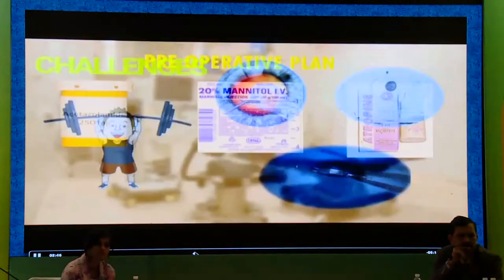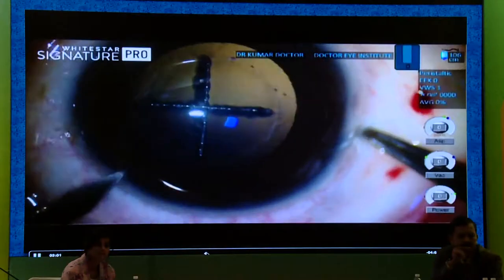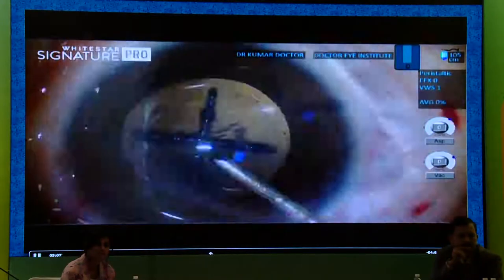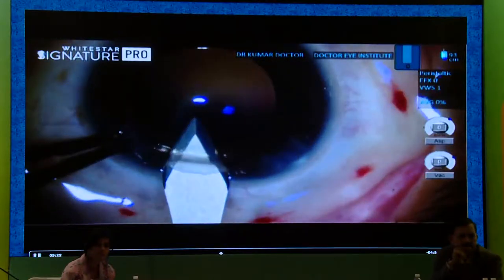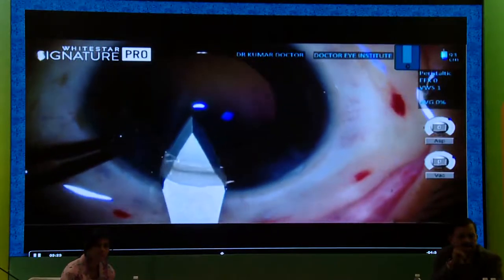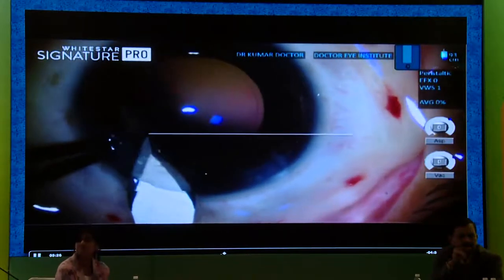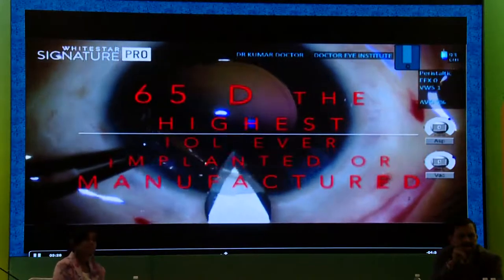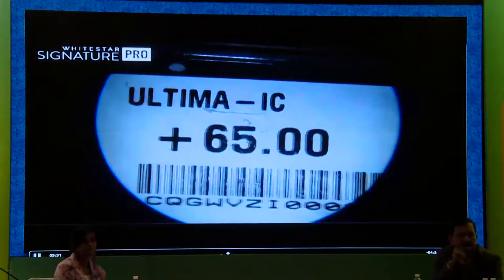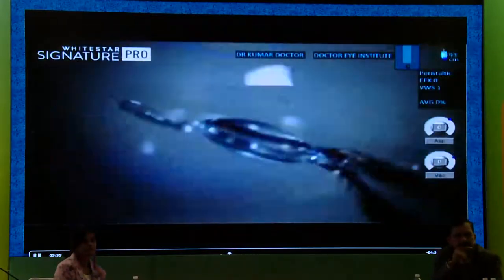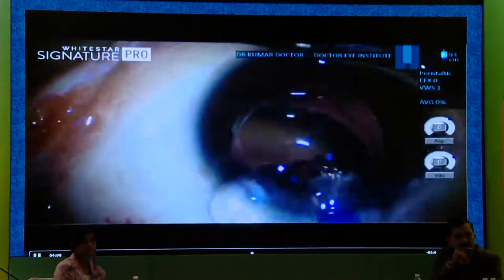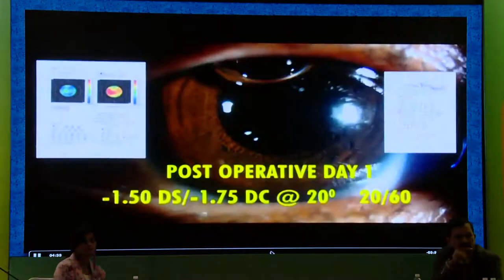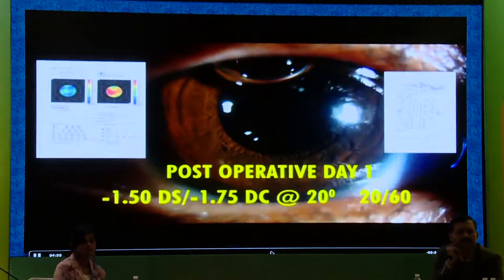I decided to proceed with femtolaser-assisted capsulotomy, a femto rhexis, side ports, micro rhexis forceps, bimanual I&A, a 3.4 mm incision. A 65-diopter IOL — the highest ever manufactured — was loaded into the cartridge and injected. A hydrophilic IOL was placed. Post-operatively, I then performed surface ablation treatment for her because of the 57-diopter steep cornea.